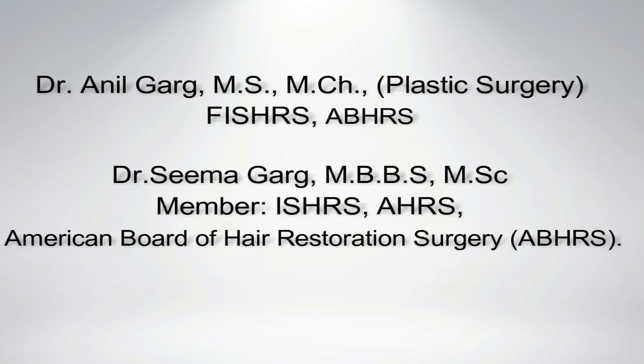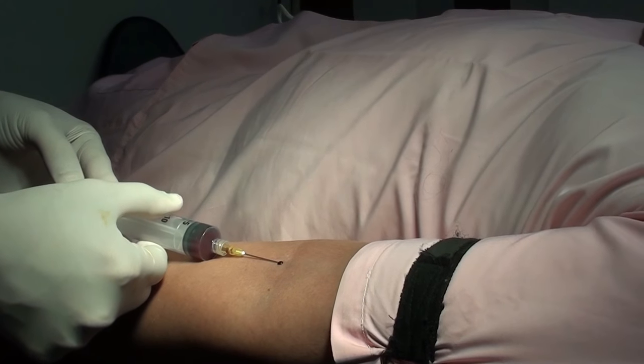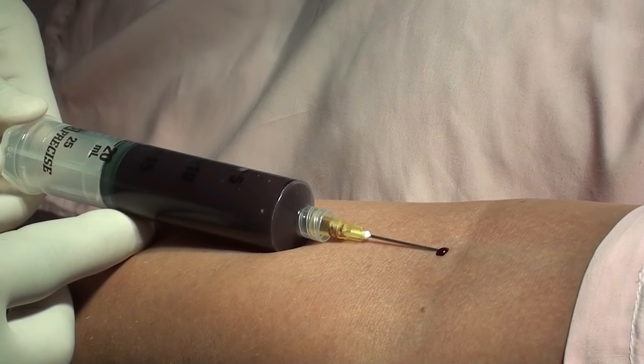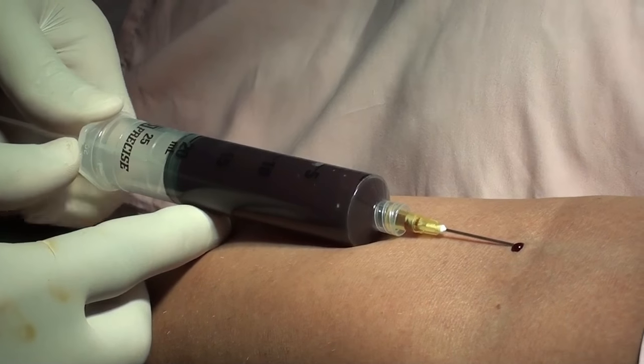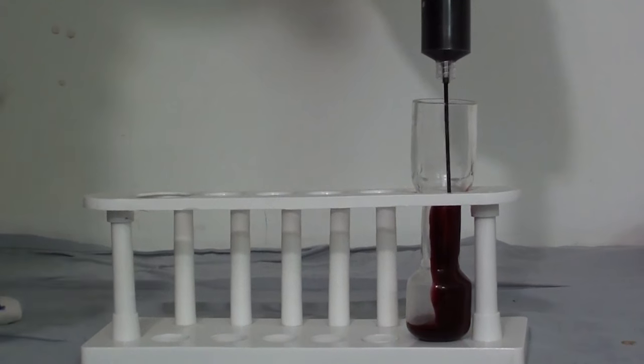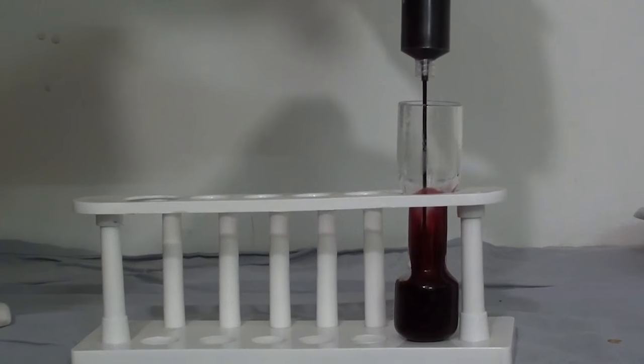Method of preparation of PRP: take 2 cc of ACD solution in a syringe and draw 23 ml of blood. Transfer this into a specialized container.